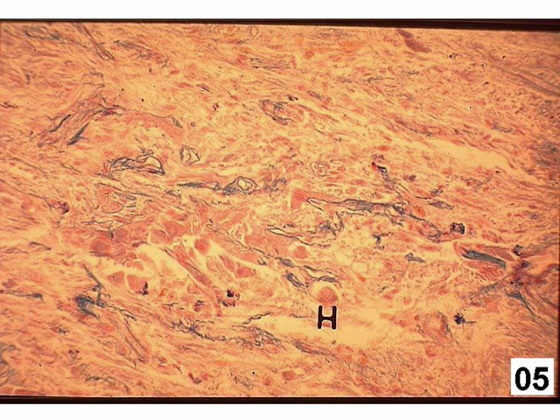There are some cells here in addition to the endothelial cells, and these cells are called pituicytes because they are supportive cells within the pituitary. They are difficult to make out in this sort of micrograph. You would only expect to be able to see some very small nuclei that are associated with the axons in the pars nervosa.